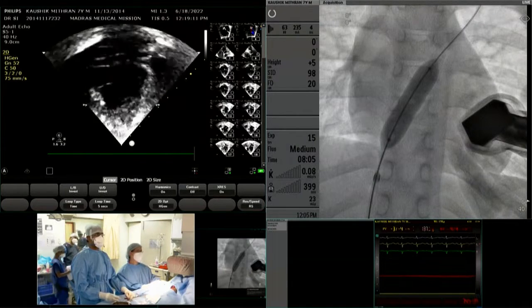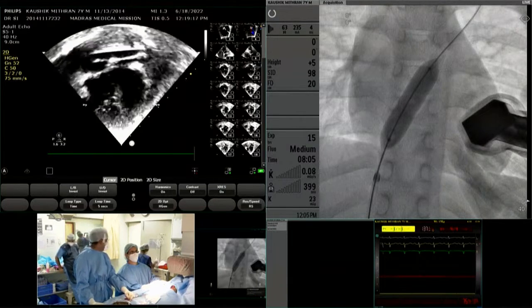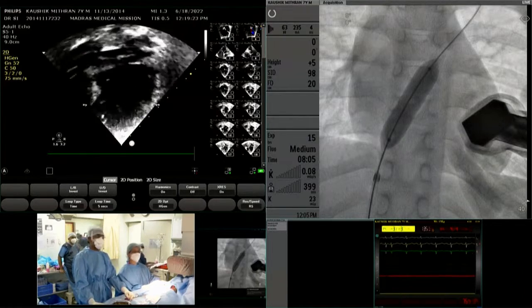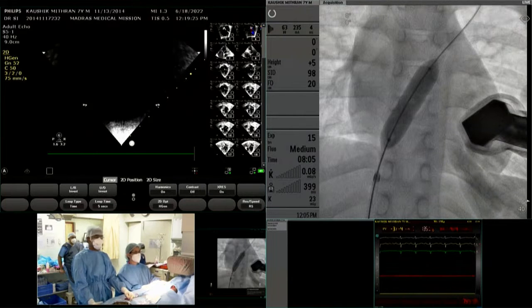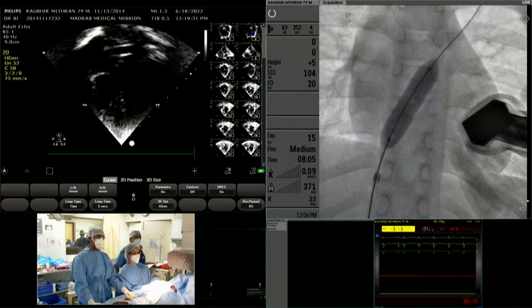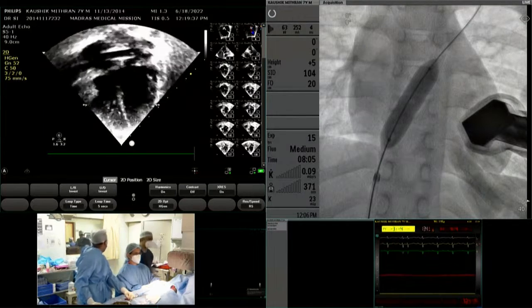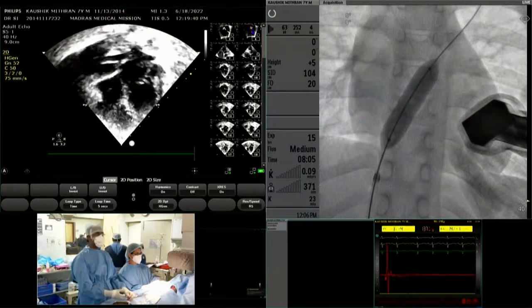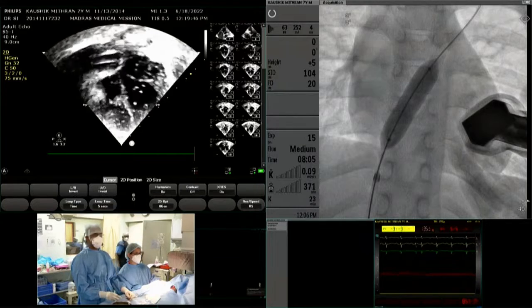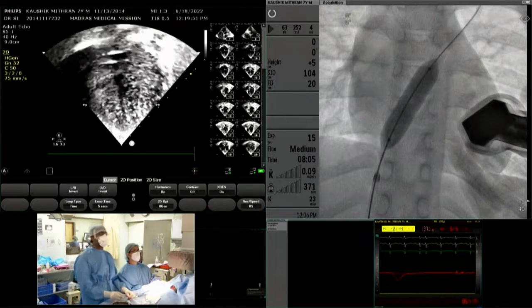Are there any other additional perforations or anything? Fenestration? We are looking at that. I am not getting a saturation climbing up. Maybe a transesophageal echo with a proper good four chamber view is essential. Get a pediatric TE probe. Okay. Yeah, we'll go for a subcostal. It's much more vigorously filling. I think there is an additional defect. It's a good idea, what you are trying to do with a pediatric TE probe. Let us see the defect.